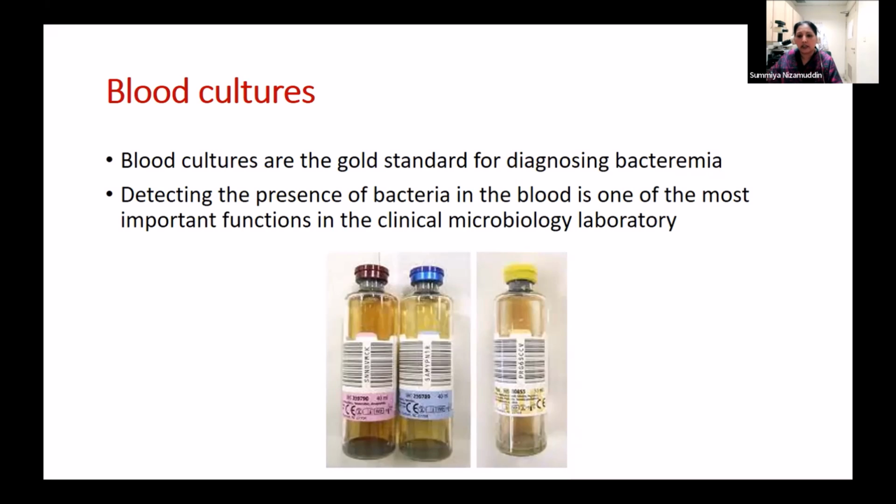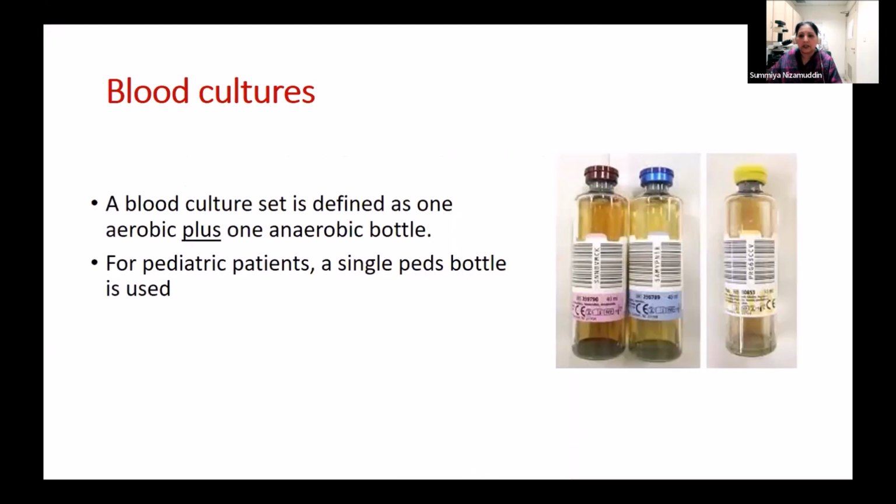So it's always helpful to find out which blood culture methodology is available in your hospital or your laboratory, because there are hospitals that are still using manual blood culture bottles, and manual blood culture bottles are dealt with differently and automated blood culture bottles are dealt with differently. It's always better to find out which bottles and which system. So we have the BacT/ALERT system in our lab.